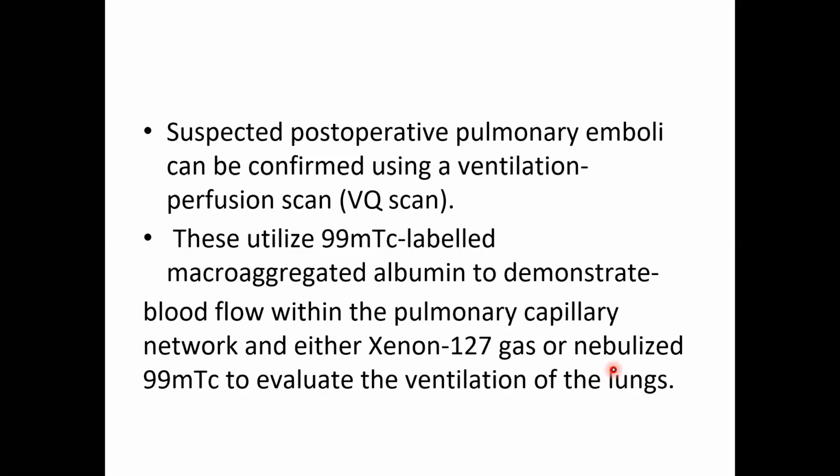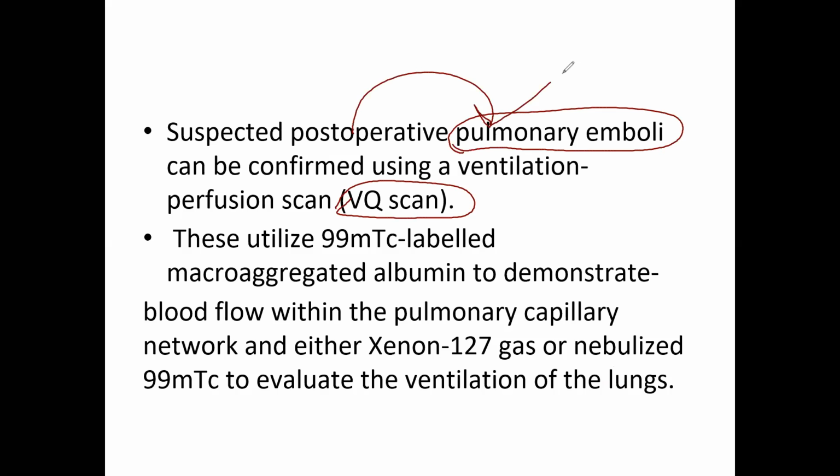So this is also very important. I'm trying to annotate this one also. When you have this ventilation perfusion scan, VQ scan, it is used for pulmonary emboli, especially for post-operative pulmonary emboli. So for post-operative pulmonary emboli, you will be doing the ventilation perfusion scan.